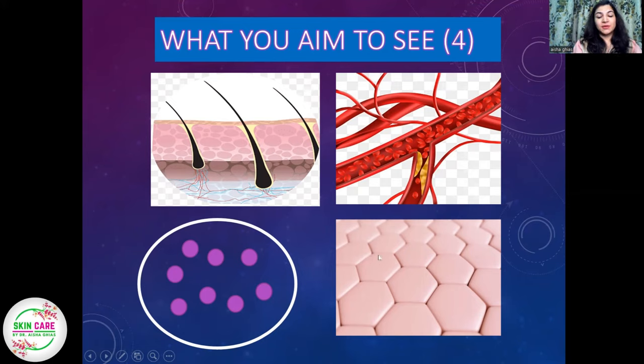The skin in general, if there is scaling on the skin, or the skin color is bad, or if there is any other disorder that you can look for over there. And the left corner, the follicular dots, it may be of different colors, yellow dots, white dots, okay. So the dots are very important.